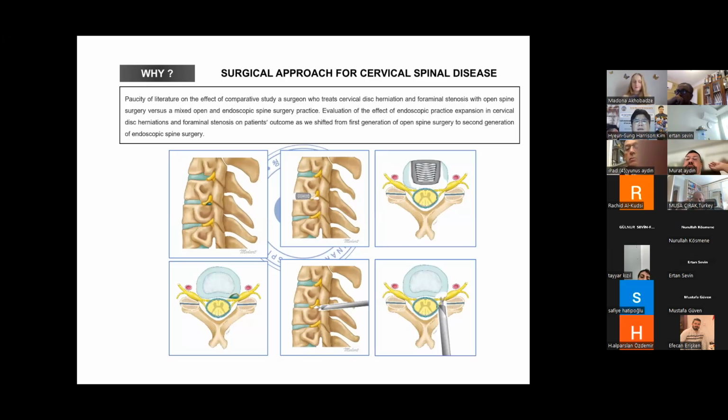But I think that maybe after the development of endoscopic spine surgery, there is nowadays a change in the generation from the anterior to posterior. I already mentioned that maybe during the last 3 or 4 years, my cervical operations increased so much, maybe monthly more than 10 cases.